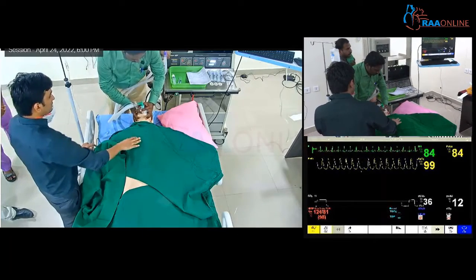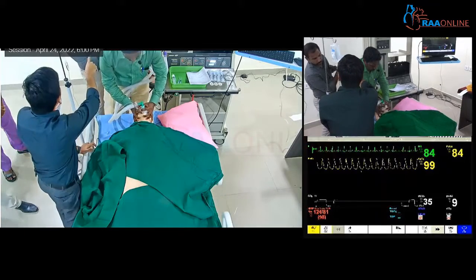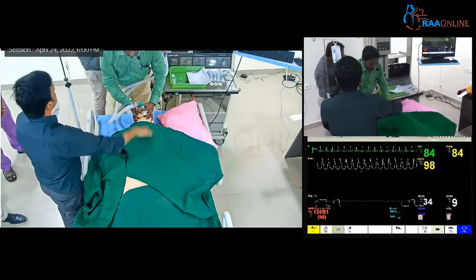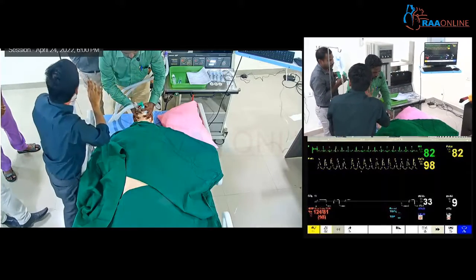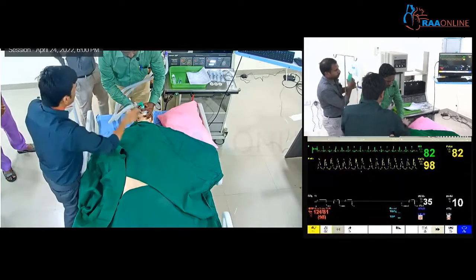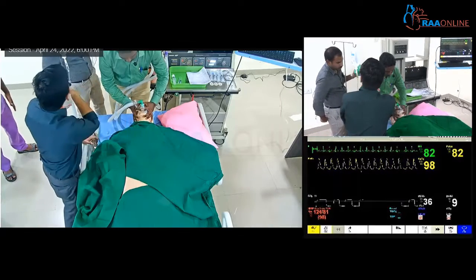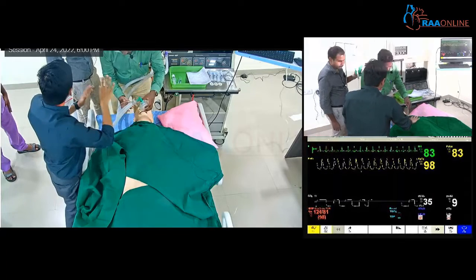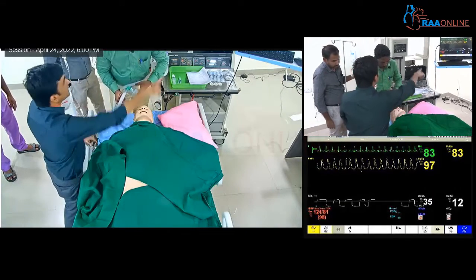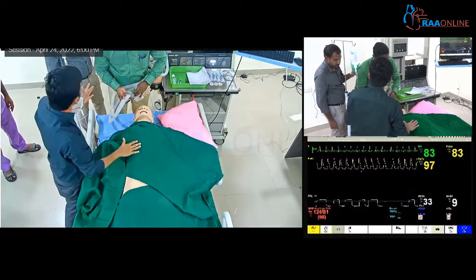Okay, so if you see, if you hold it, even if there is a leak and the bag is not filling, if the chest is rising and the EtCO2 is coming, that means it is getting ventilated. This is because the SimMan has some problem with its structure. It's not pliable like us, so there is some leak. Good ventilation means the chest rise will be there and you will get EtCO2, even if the bag is not filling properly. Is that okay?